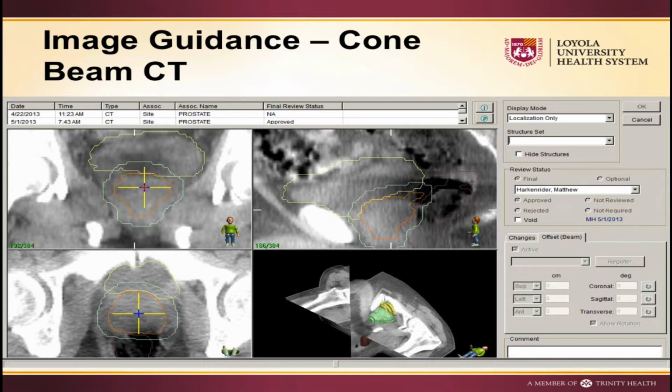Those arms, as I said, can also do a quick CAT scan. So those arms come around, they take a series of X-rays that get reconstructed into 3D images. It's called a cone beam CT. And we get pictures that look like this. So this is the axial view. It's kind of blown up.